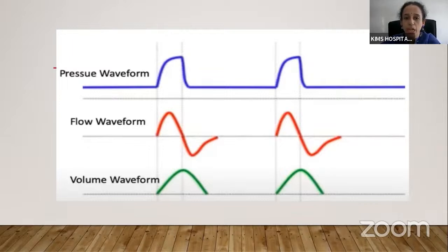As the airway pressure increases, air always flows from the higher pressure to the lower pressure. At the end of the inspiratory phase here, both the airway pressure and the alveolar pressure will be equal. Then the decelerating phase starts, but the I time does not end here. I time actually ends here. Then the baby will go into expiration.